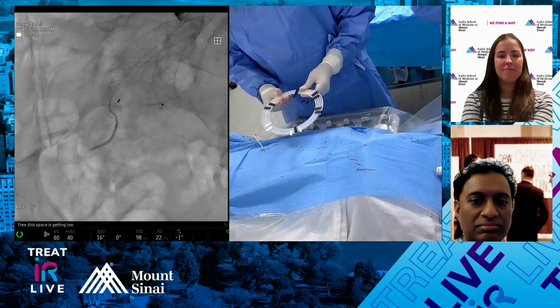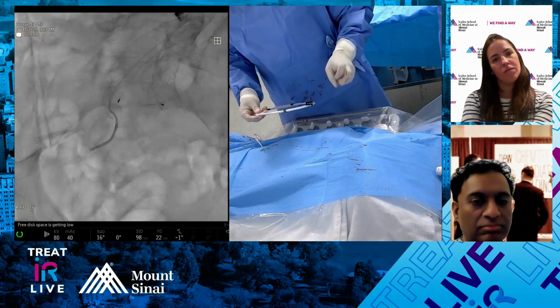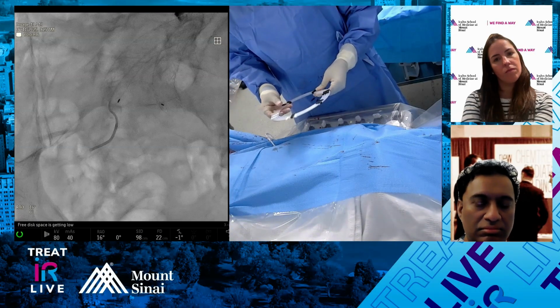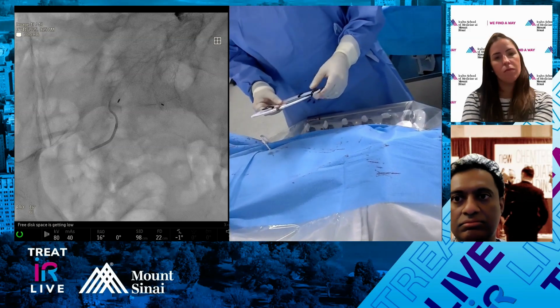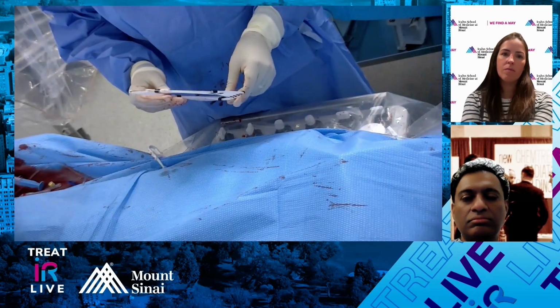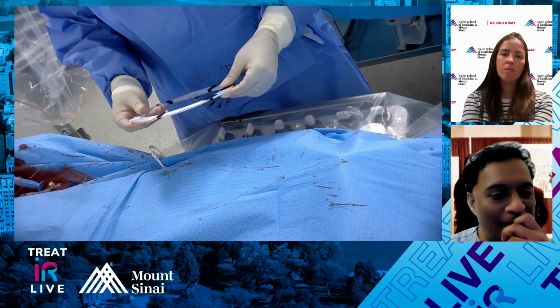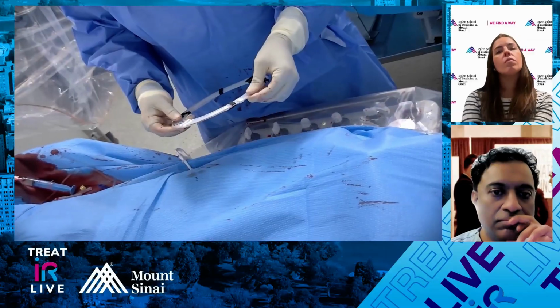Yeah, and so these are their new 035 coils. They're actually 030 outer diameter, so it's the largest volume coil on the market. There are only about two or three detachable 035 coils out there. So it's either this one, the Terumo, or technically the Retracta, the Cook coil, which is fully retractable. The 035 interlocks are great. The problem is that it's a passive detachment. They're a little bit stiff, so sometimes can be a bit tricky.